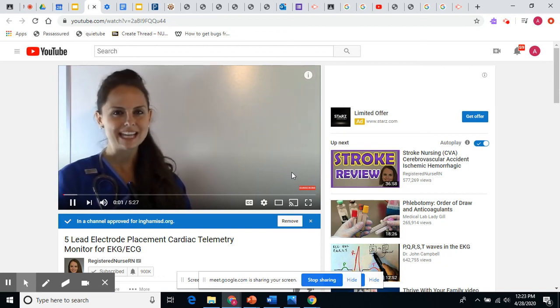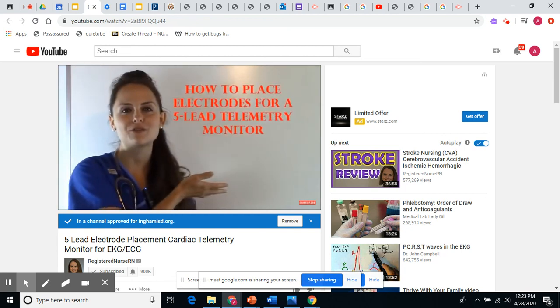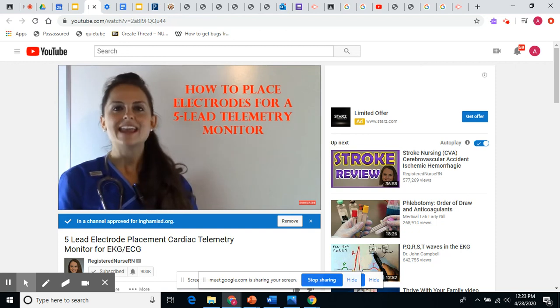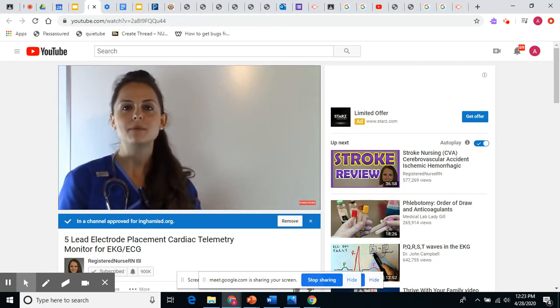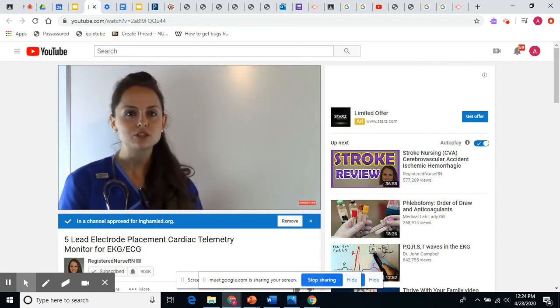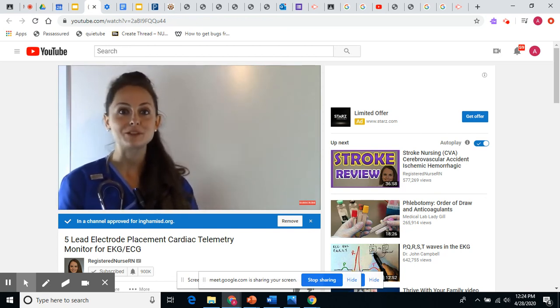Hey everyone, it's Sarah with RegisteredNurseRN.com, and in this video, I'm going to demonstrate for you how to place electrodes for a 5-lead telemetry monitor. Now, in the hospital, a physician may order a patient to be a telemetry status where they will wear a telemetry box during the whole hospitalization, and their heart rate and rhythm will be monitored by a telemetry unit.